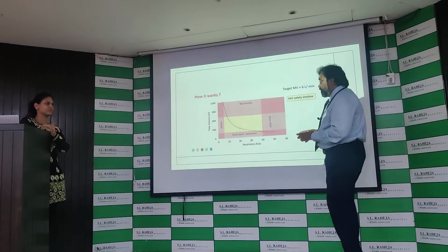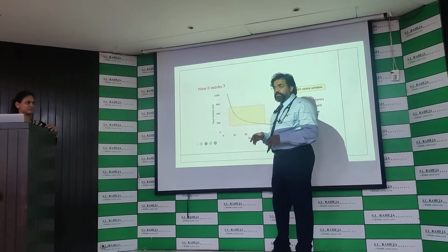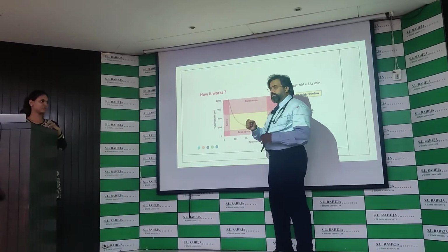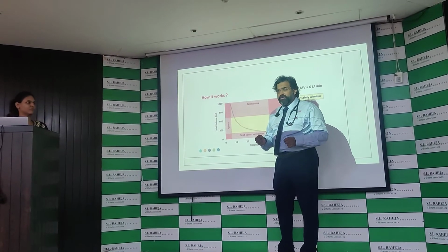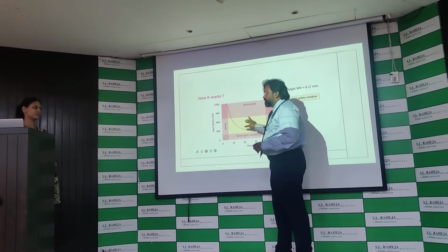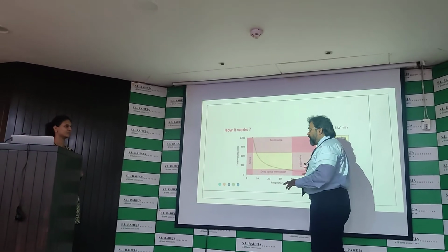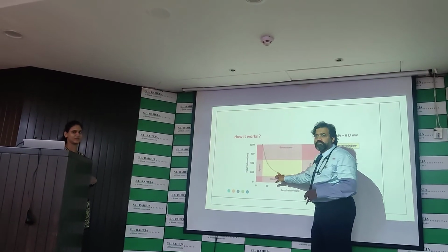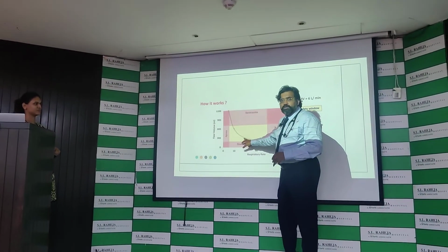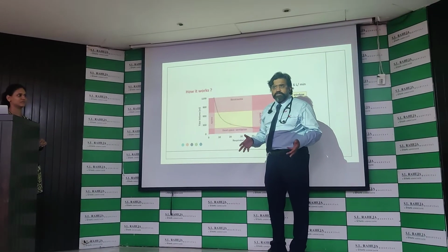So if it was normal, this is how it is. It will ventilate this patient inside this box, but there will be a plus sign on the ventilator, which will ventilate the patient inside this box. So somehow the plus goes out here. Very soon you will see all the changes happening and the plus coming back inside this. Okay, so you don't have to do anything.